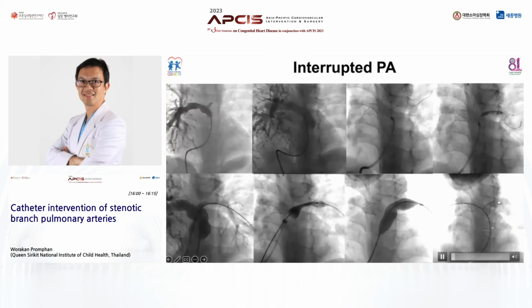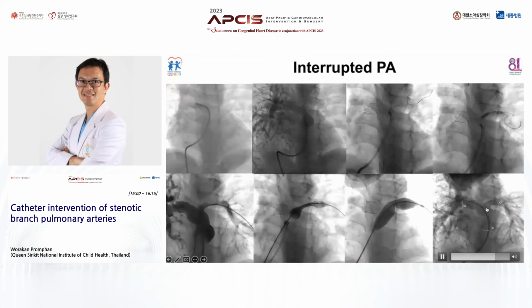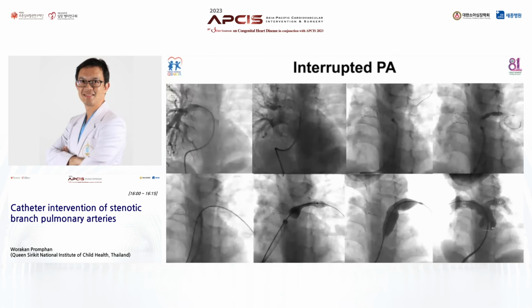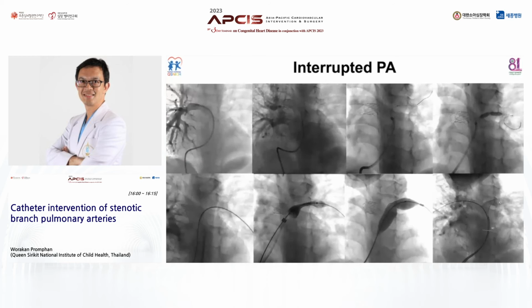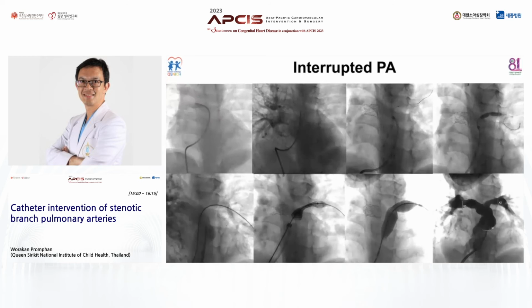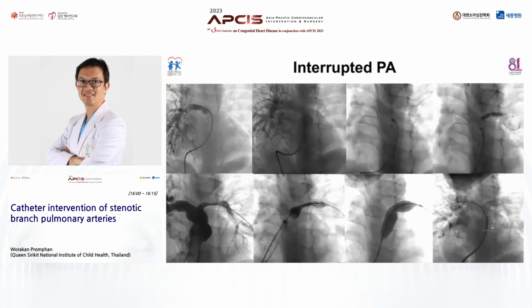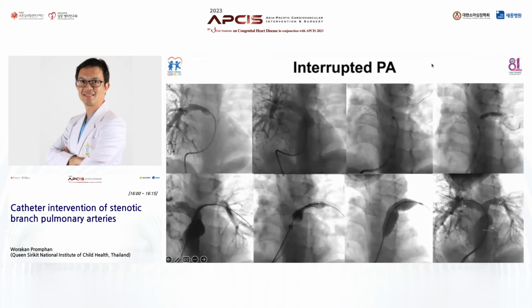Of course, you have to redilate again. So I personally try not to completely open it up from 0 to its nominal diameter. There's no rush, unless you have very difficult access in the future, in which case you may need to try to increase the size as much as possible. But in this particular case, in the next 6 or 12 months, you can come back and use a higher pressure balloon to dilate it and make it bigger.